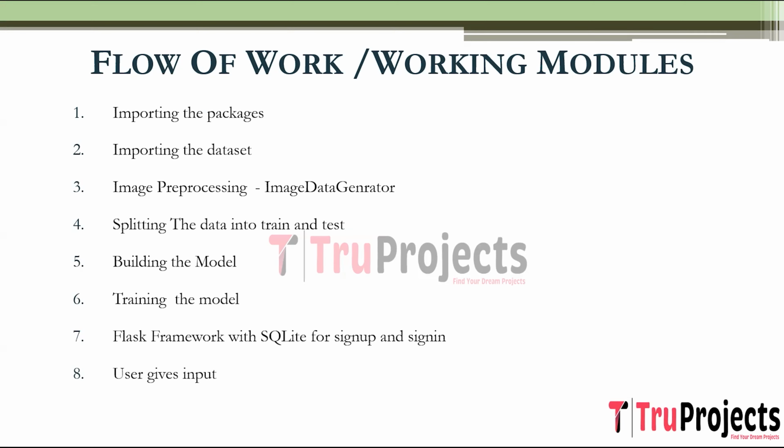The next step is user gives input. In this step, the user provides input to the system, typically in the form of uploading histopathology images for malignancy prediction.